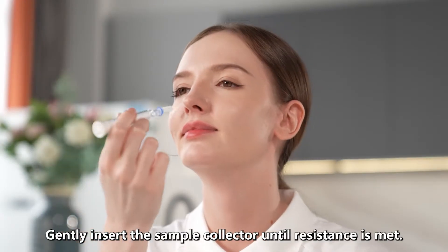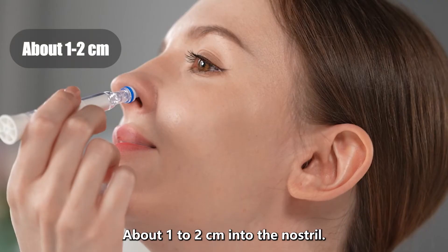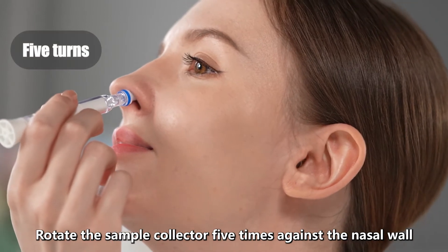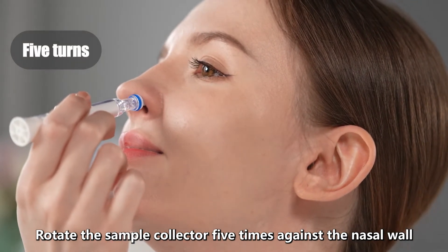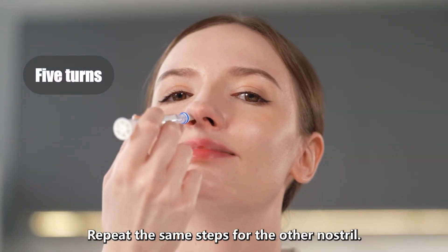Gently insert the sample collector until resistance is met, about one to two centimeters into the nostril. Rotate the sample collector five times against the nasal wall and remove from the nostril. Repeat the same steps for the other nostril.